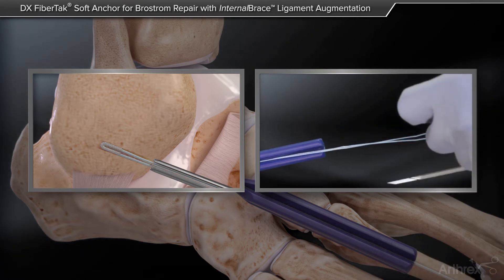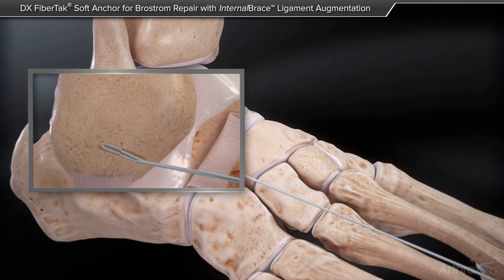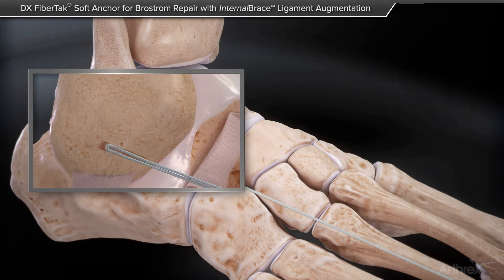It's hard to really depict in this video. However, if you pay attention to the tip of the suture anchor, as you pull back, the suture anchor creates a slightly bigger knot, preventing a pullout.